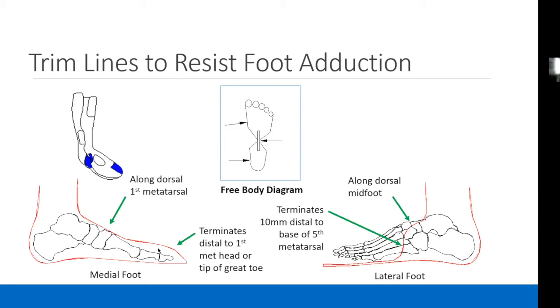the hallux. And sometimes, especially in older kids, not in infants, where you're managing a clubfoot with an AFO after the Denis Browne splint has been removed, sometimes we try to utilize as much bearing area as we can, which is the great toe as well as the first metatarsal head for that. Here's what it looks like, these 3 points in the orthosis in blue.